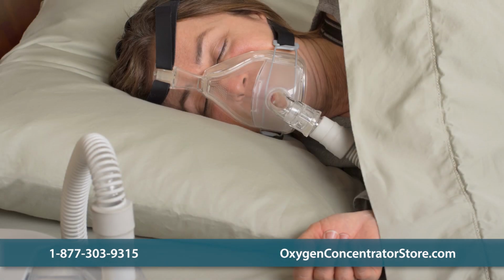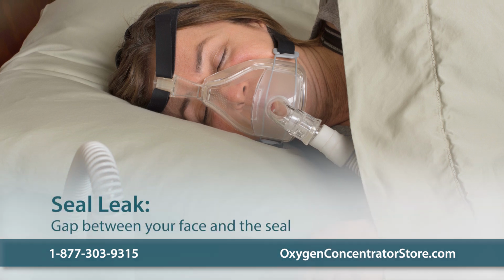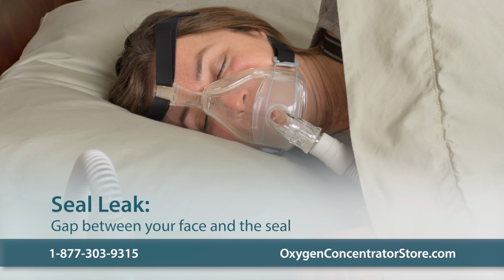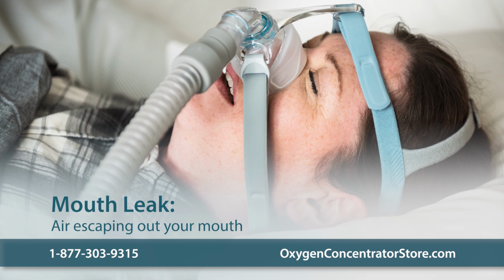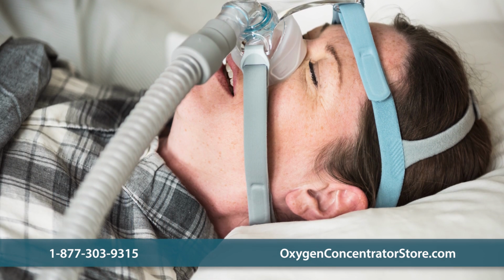There are two main types of leaks: a seal leak and a mouth leak. A seal leak is the most common kind of leak, caused by an ill-fitting mask when there's a small space between your face and the seal. A mouth leak happens when you breathe with your mouth open and air coming from the mask escapes from your throat out of your mouth. Both of these leaks can cause the same problems.